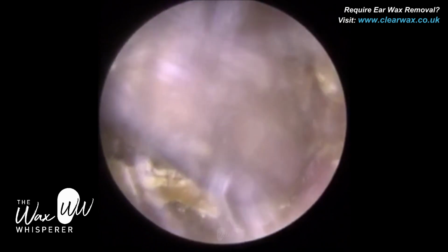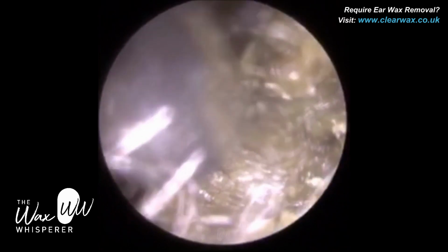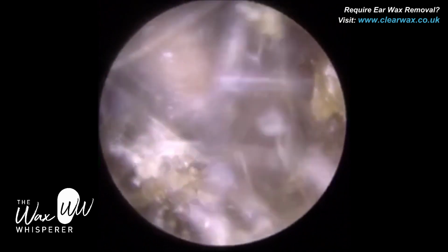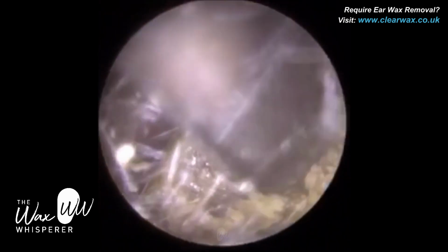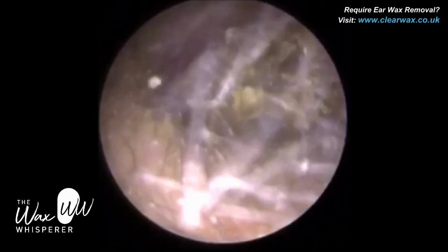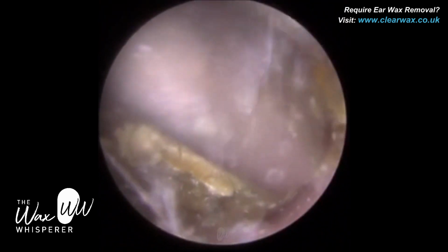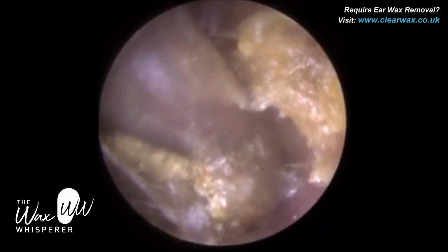So it's just past probably the first centimetre of the ear canal. We know we're more lateral near the entrance because of the hairs. Patient did have a few hairs on both sides. But these hairs are only found on the outer third of the ear canal, the cartilaginous portion. That's where the hair follicles are. You shouldn't really find any hair follicles in the inner two thirds of the ear canal, because the inner two thirds is a very thin layer of skin, less than 0.1 millimeters of thickness, tightly adhered to the temporal bone. The temporal bone is the bone that encompasses the ear canal, and there shouldn't be any hair fibers here.